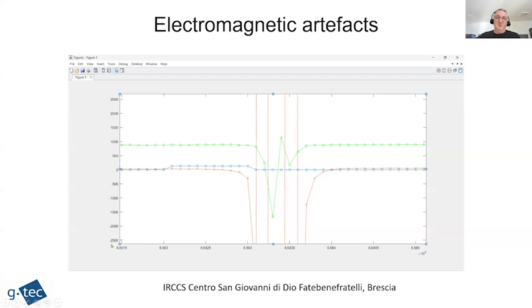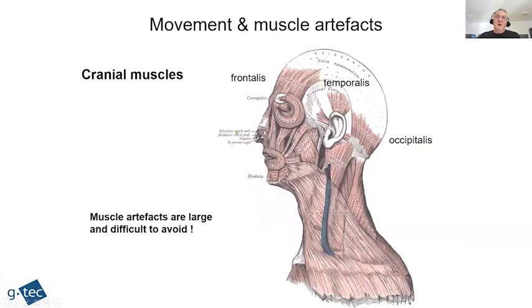So this is plus minus 2.5 millivolts. So some channels might have a minor artifact, so to say, although 4 millivolts is not a minor artifact, but you could have as much as 50 or more millivolts on the electrodes that are closer to the coil. This is the example recording of one of our clients from Brescia, from Italy.